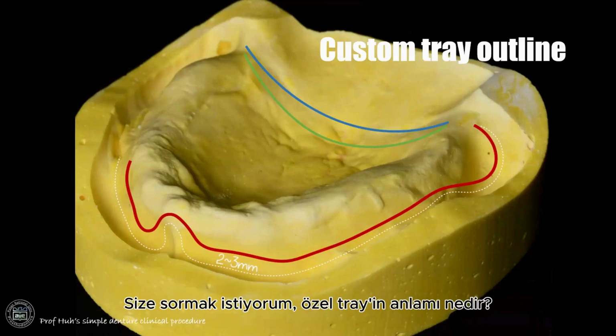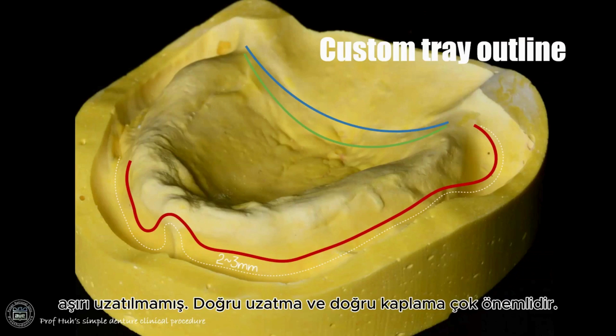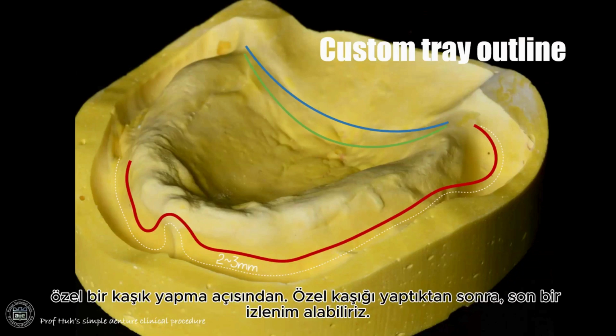So I want to ask you, what is the meaning of a custom tray? I believe a custom tray should only cover the edentulous area properly, not be overextended. Proper extension and proper coverage are very important in making a custom tray.